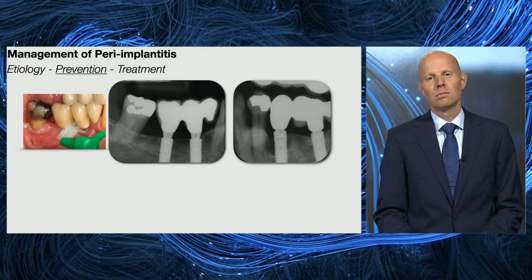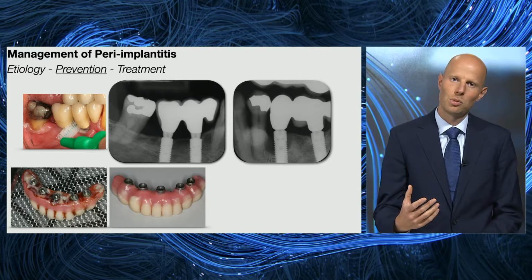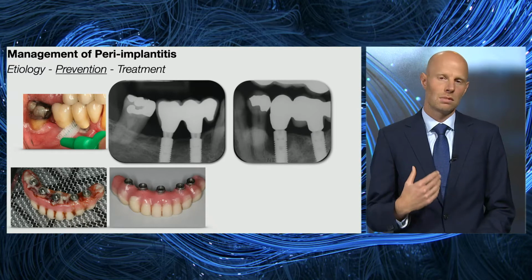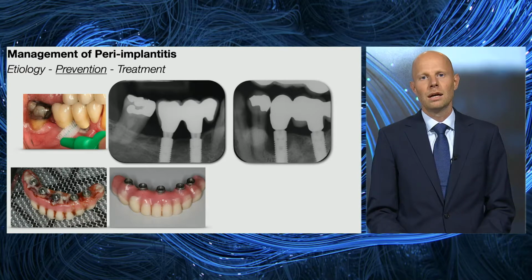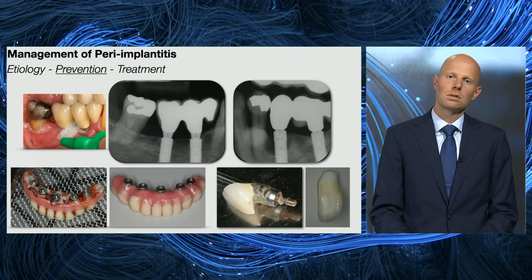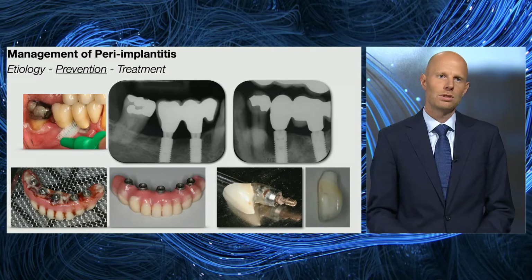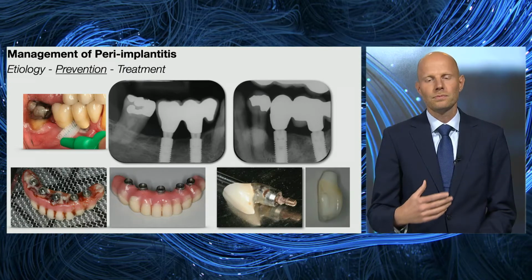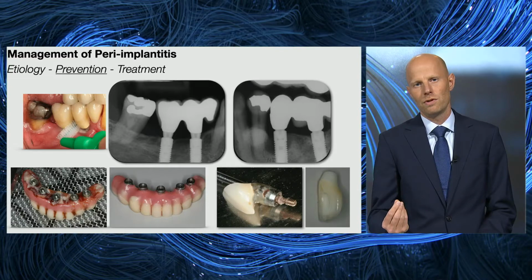If now the prosthesis prohibits proper plaque control and access for the patient, we have to adapt these prostheses. And this is something in our hands, an everyday aspect, that we change and adapt our superconstructions. We also have to redo superconstructions as a preventive measure. Ideally, a crown that you see here to your lower right should of course be redone before a problem occurs. And to me, this is also a preventive measure.